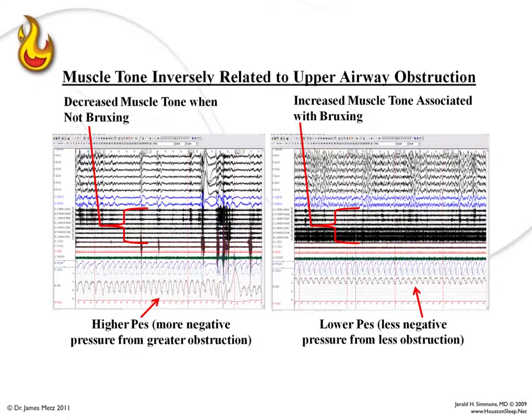So what is that? Well, that's a TMJ patient, the one on the right. The one on the left is a sleep apneic patient that has lost the ability to brux. I can talk to you more about that, but that's an important point.